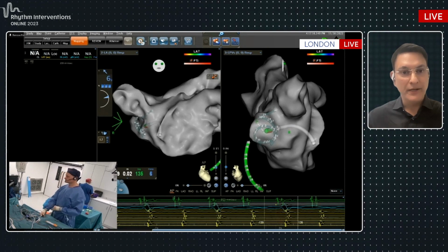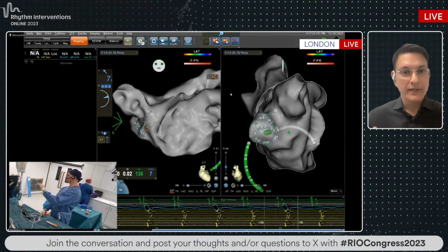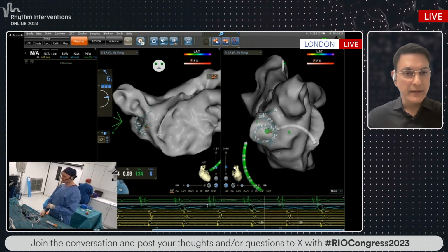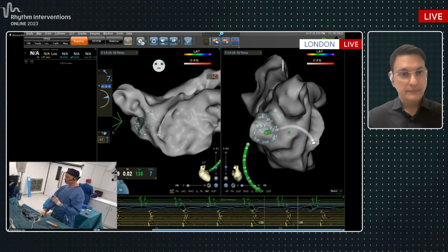If the entrainment is well out from the distal coronary sinus electrodes by over 100, then it would be suggestive of a right atrial flutter and that kind of thing. So I don't know if Richard has tried entraining the tachycardia at all so far. Well, I'll come back to that.